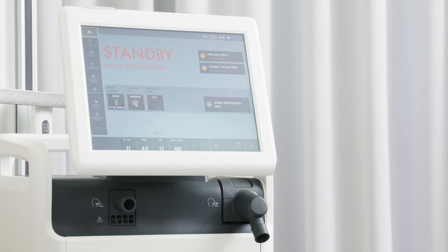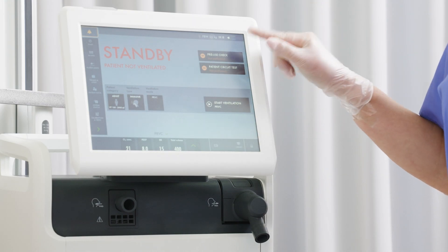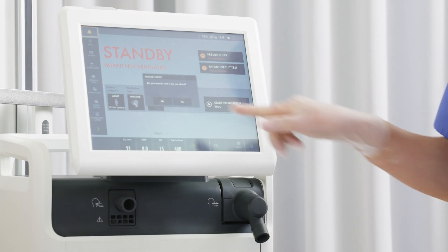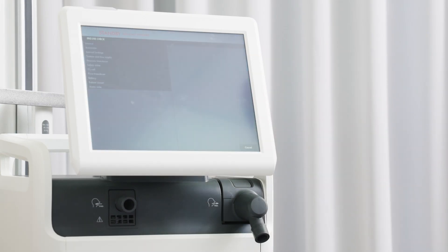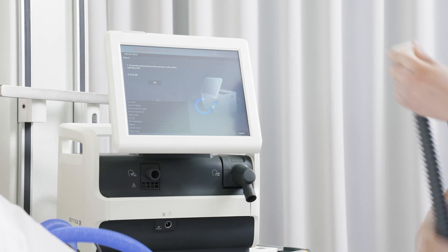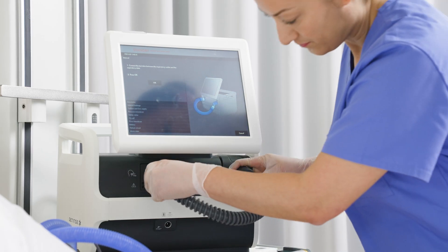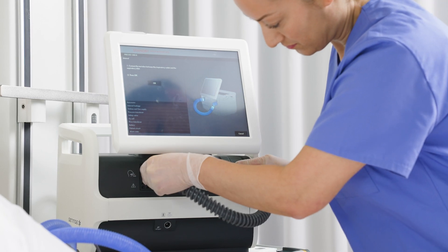Begin the pre-use check. Follow the on-screen instructions and remember to use the test tube during this check. The pre-use check takes a few minutes.